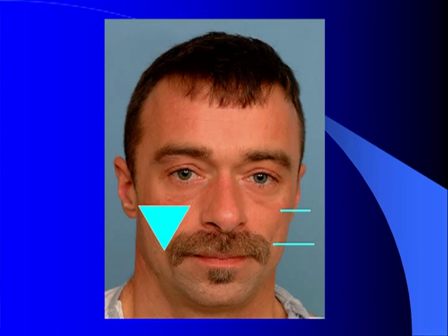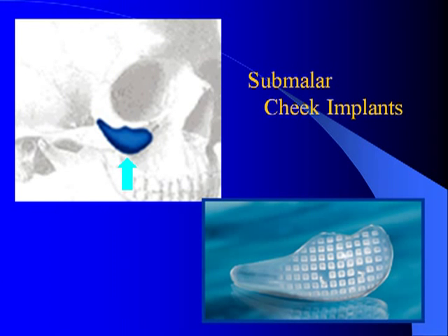If you look at this submalar cheek deformity, there is tissue missing in the buccal fat pad area as well as below the prominence of the cheek. Therefore, its treatment needs to add volume to this area. The submalar cheek implant is relatively ideal for these patients.